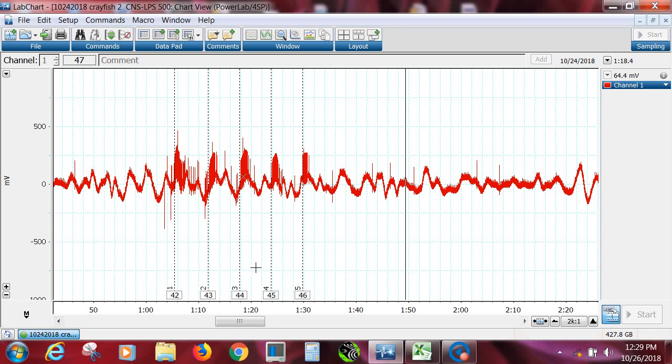If you don't see these comments, it might be a little difficult to analyze. Let's address that if you don't have them, and maybe we have to send the time points for when we added, or when we stretched, or when we brushed on the side of the animal, for your measurements, because what we're going to do later is measure the frequency over a set period of time, probably 2 seconds.